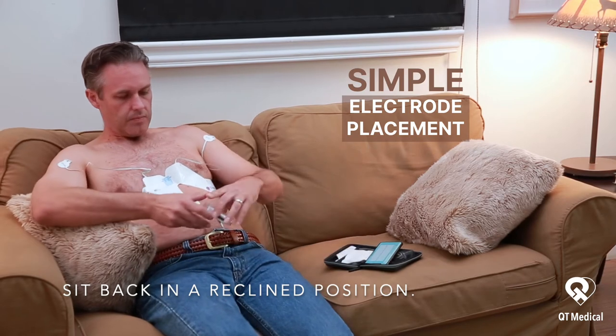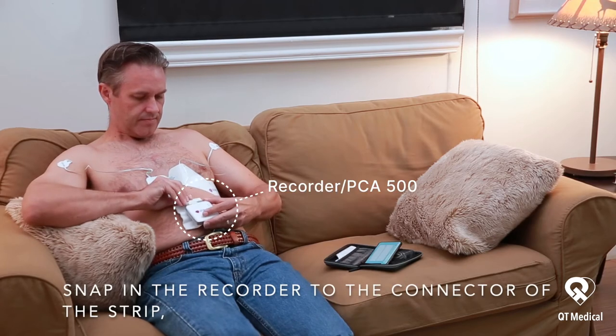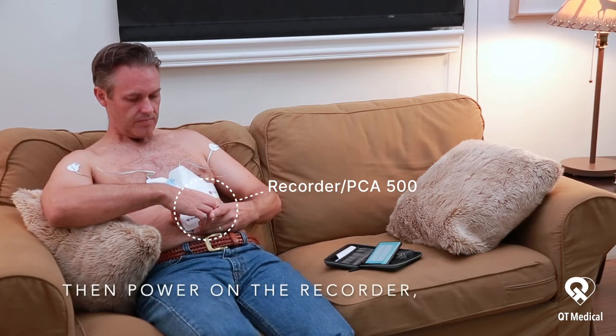Sit back in a reclined position. Snap in the recorder to the connector of the strip, then power on the recorder.